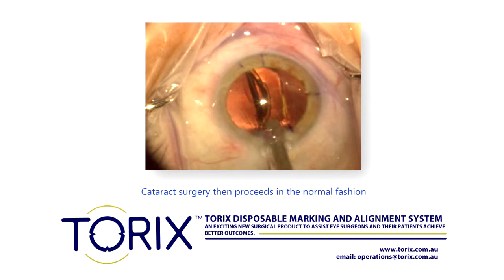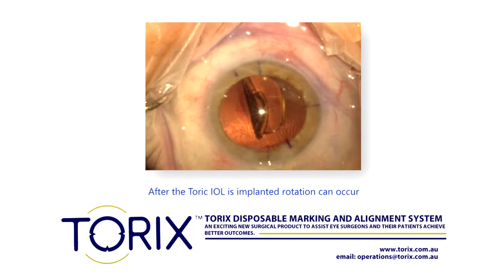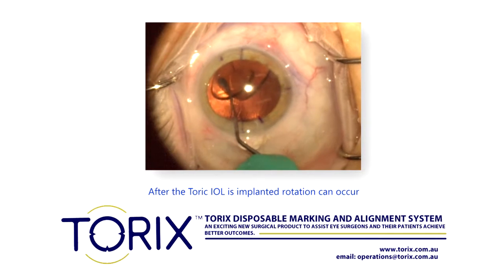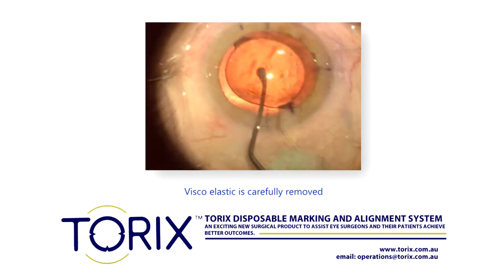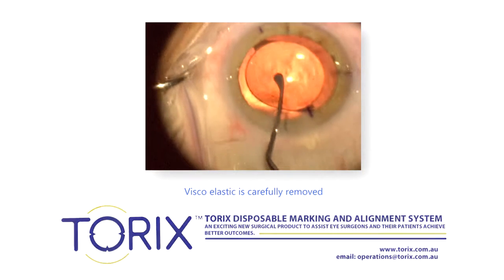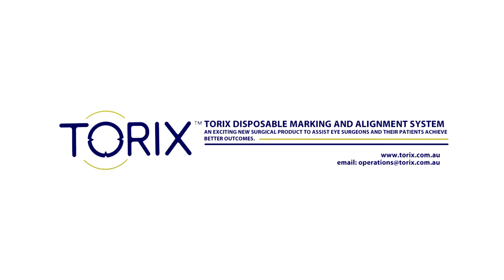Cataract surgery then proceeds in the normal fashion. After the Toric IOL is implanted, it is then rotated to align with the steep axis marks as viscoelastic is carefully removed. More information on the Torix Disposable Marking and Alignment System is available at torix.com.au.